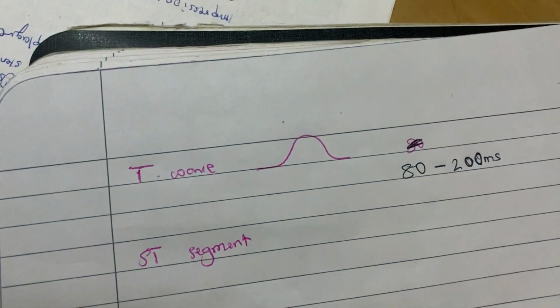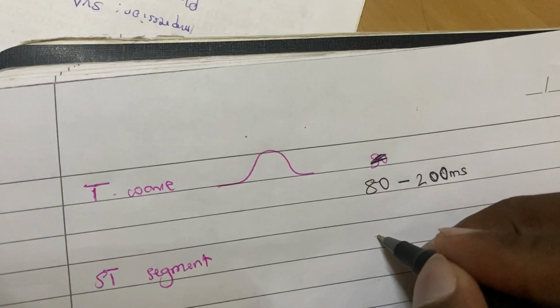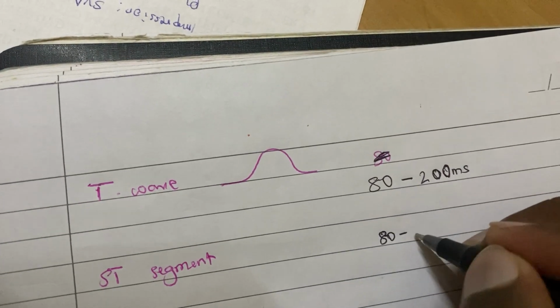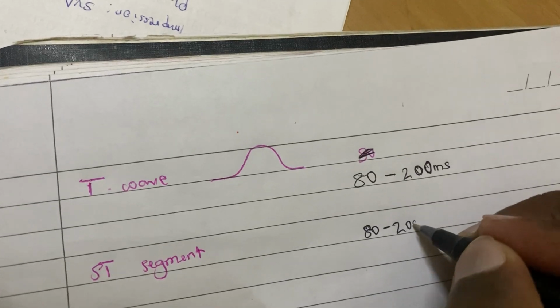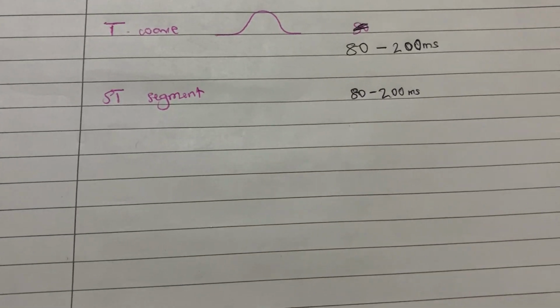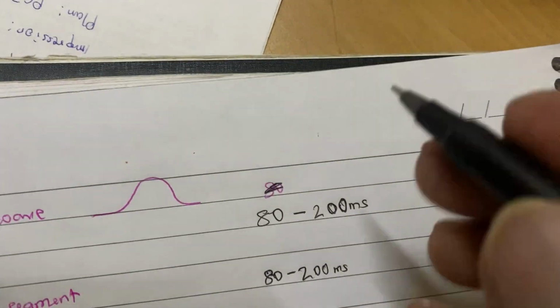It should also be in almost the same range, around 80 to 200. You can consider it only under certain circumstances.